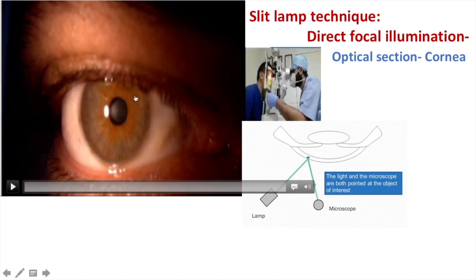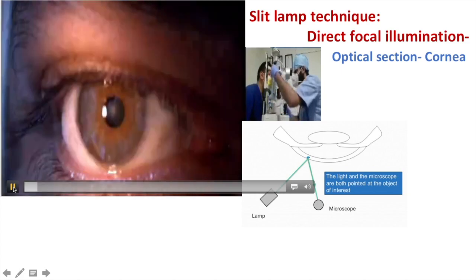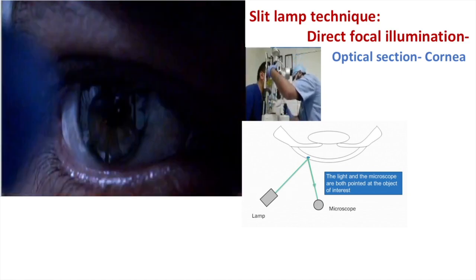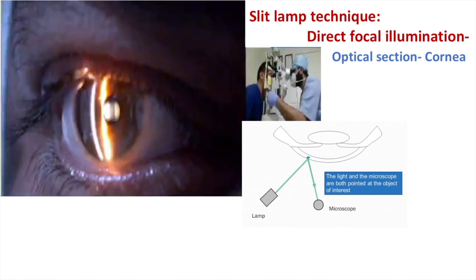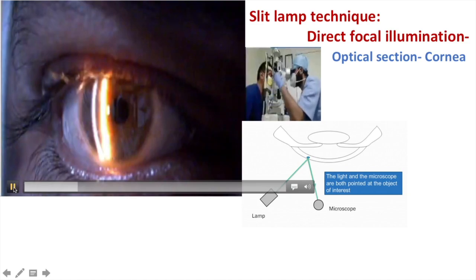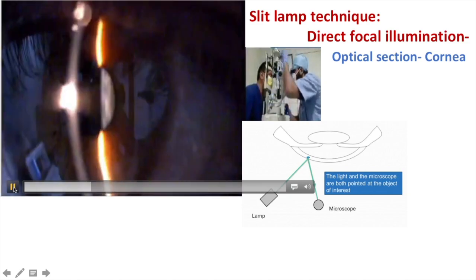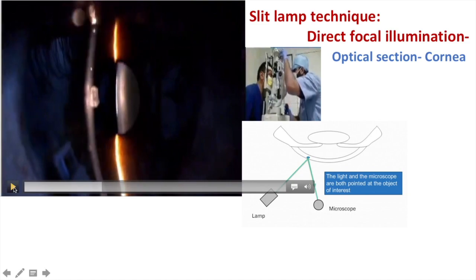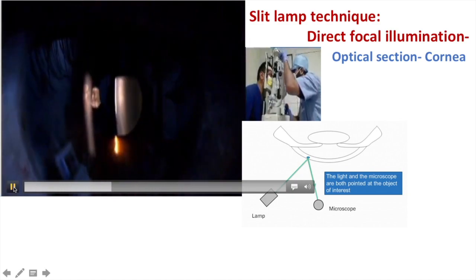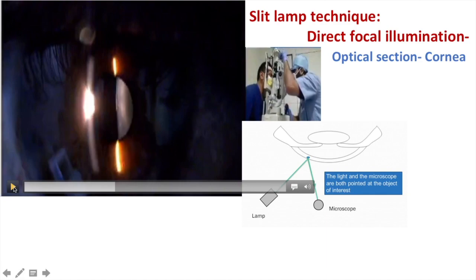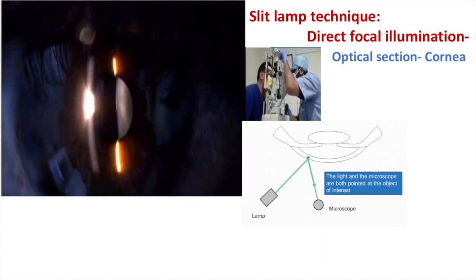Here you can see the diffuse illumination. What I will do is remove the diffuser first and then make a slit. Now when I make a slit, I can increase the illumination. You can see there is a slit of the entire cornea, but the periphery of the cornea is a little steeper, so I can decrease the height of the slit and make the width very small.